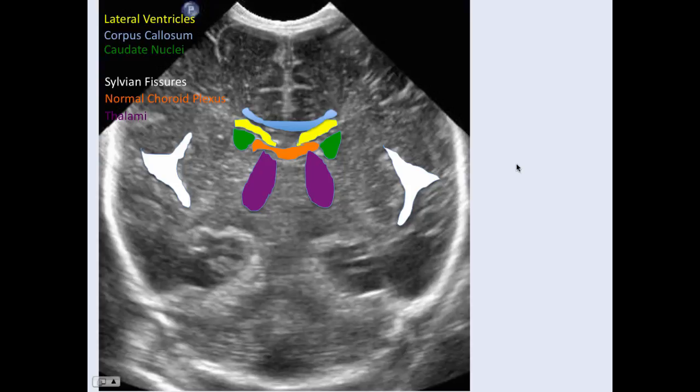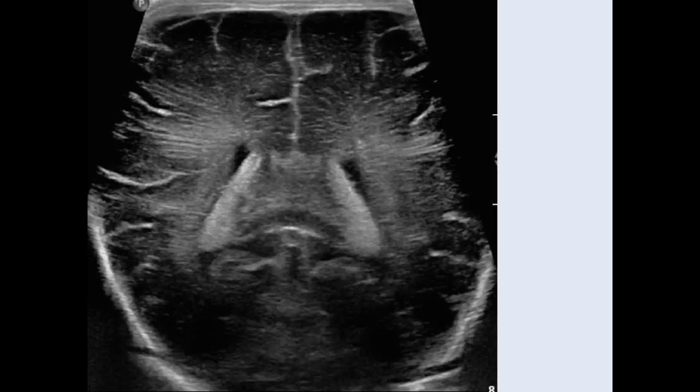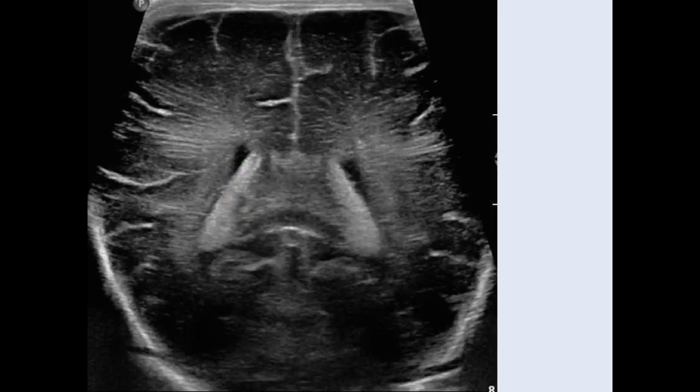We start to get a little bit of the thalami as we move more posteriorly. Extending more posteriorly still, we encounter more of the choroid plexus. This is the normal echotexture and appearance of the choroid plexus. The choroid plexus is normally the brightest structure within the brain, and we use that as an internal reference when assessing for certain abnormalities. The choroid should be fairly symmetric, although the choroid plexus can have irregular contour as well as clefts and other things that can make them look a bit irregular. They should also have fairly homogeneous echotexture.